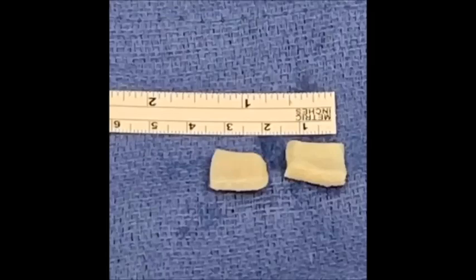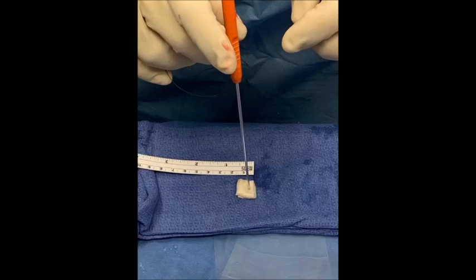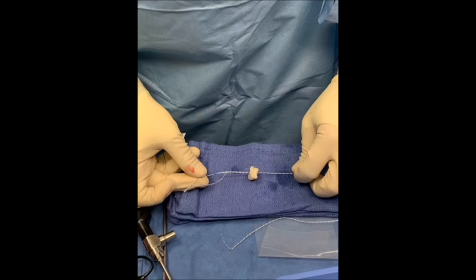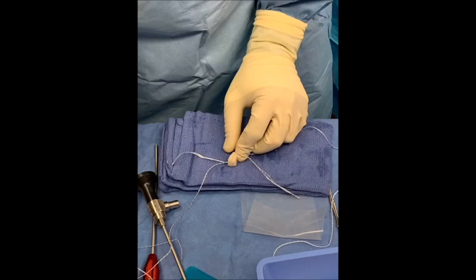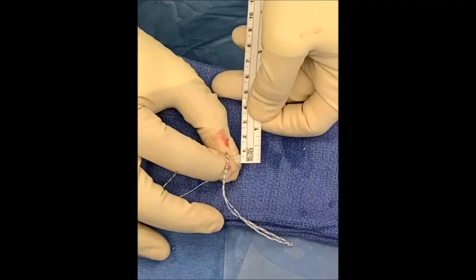In terms of graft prep, 1 centimeter by 1 centimeter dermal allograft that are 3 millimeters thick are stacked. A suture passing device is used to pass a suture link through the graft. You want to make sure that the loops of the suture links are going in different directions in order to create a mattress once the graft is brought into the field. The graft is measured to ensure that it fills the defect, in this case 5 millimeters.